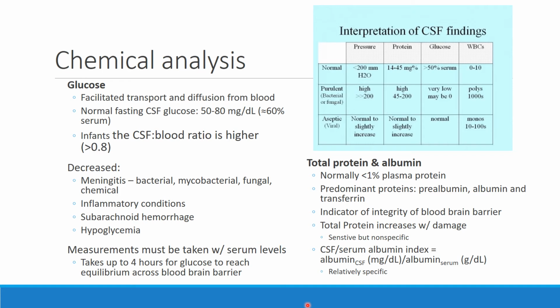And in a hospital like Sloan, you might have more than one method available depending on what's going on with the patient. Are we talking about very low molecular weight proteins that we have to try to detect? Are we talking about just large volumes of proteins? It really depends on what you're looking for, and which method you should use. The only thing you need to know is that we don't use the same methods for CSF protein detection as we do for serum protein detection. So you can't just run it on the instrument in the same way you would run a plasma.